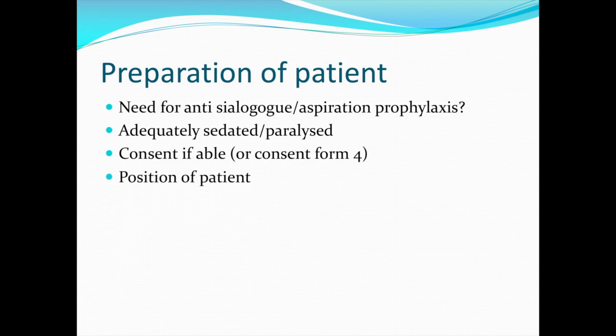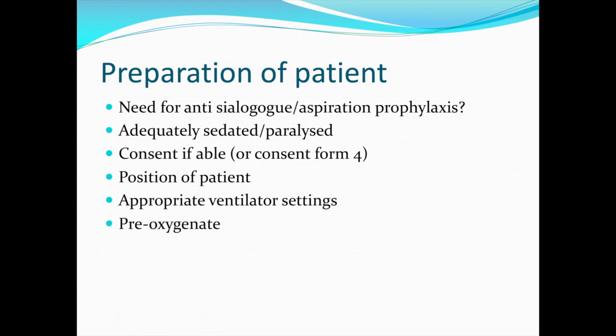Position the patient appropriately to ensure the best view for you and ensure that the bed height is good for you as an operator. Ensure that the patient is put on appropriate ventilator settings before you start, and pre-oxygenate the patient to ensure that the lungs are denitrogenated before starting the procedure.